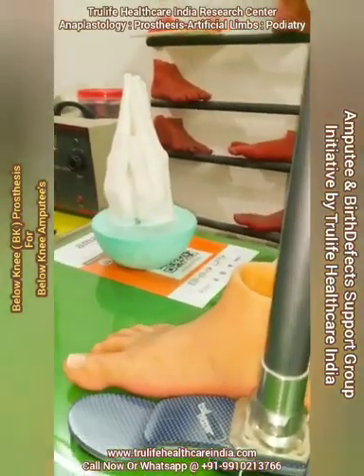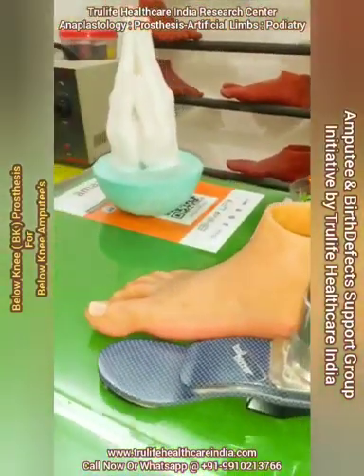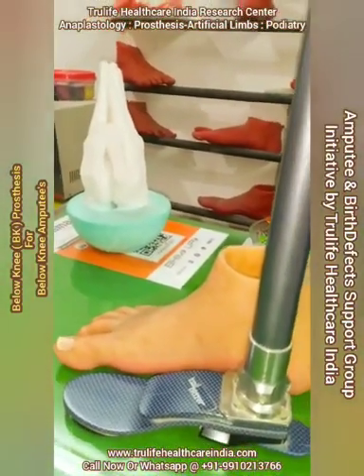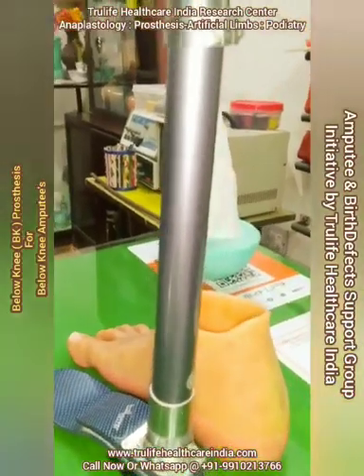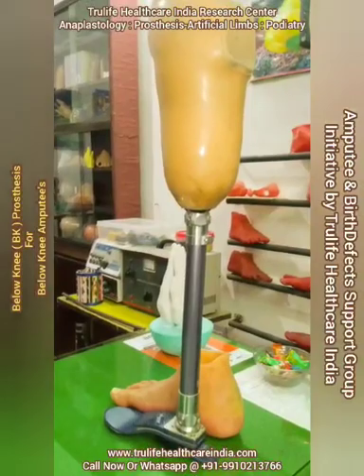Here you are seeing a silicone foot covering, which gives 100% cosmetic look. It is customized according to the patient's skin color, structure, shape, and texture to match a normal-sized foot. You can imagine how it will look after wearing it.